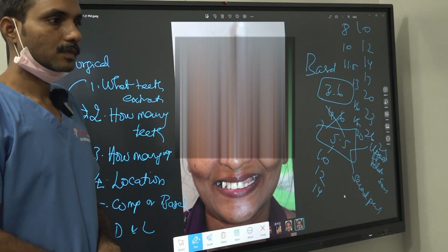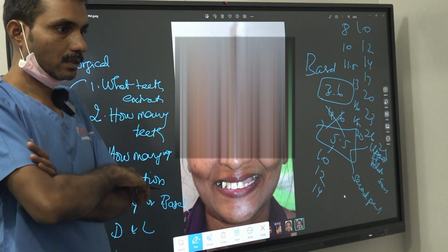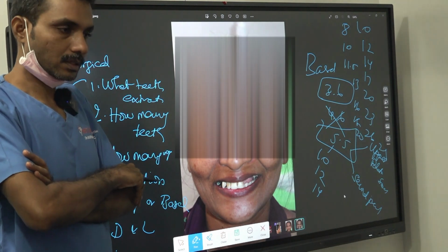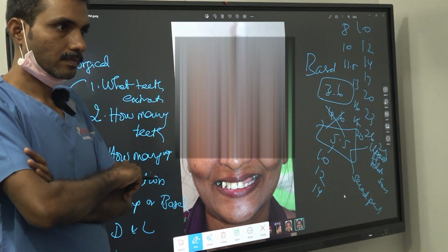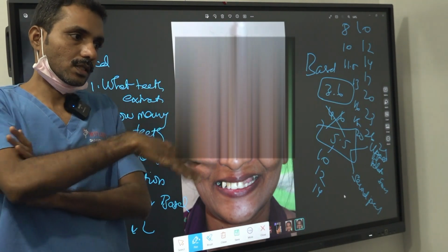This is 5.5, sir? Yes. That is 3.6. You can see the difference in diameter. The golden one is 3.6. Yes. So 3.6 comes in golden only. It's not like that for every company; the Biron company gives all in golden color.